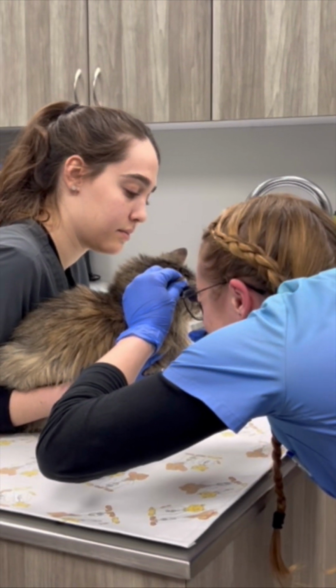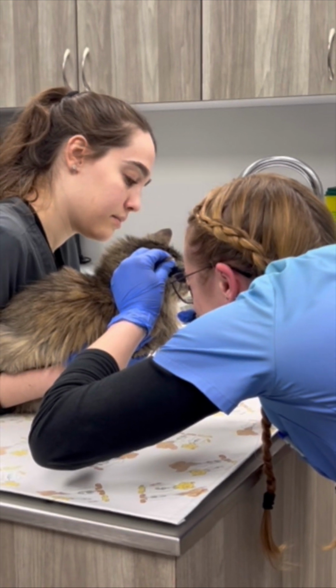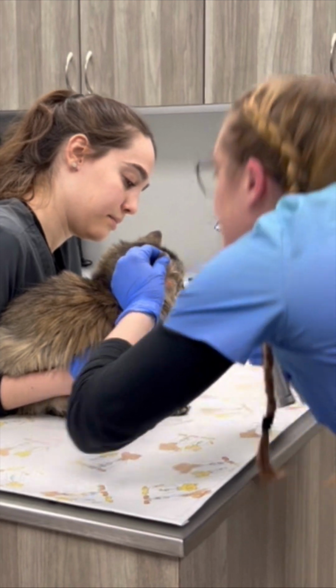Again, I have full visualization of the tympanic membrane. It is a light pink color, and there's no redness, fluid buildup, discharge, or any other abnormalities in this ear as well.